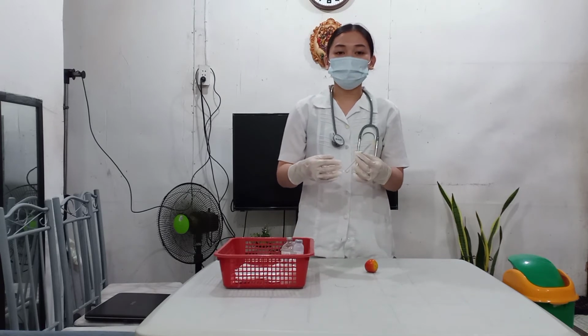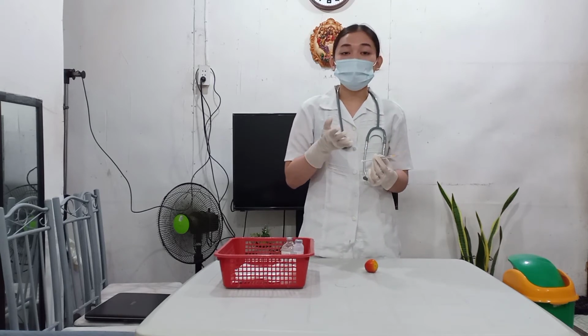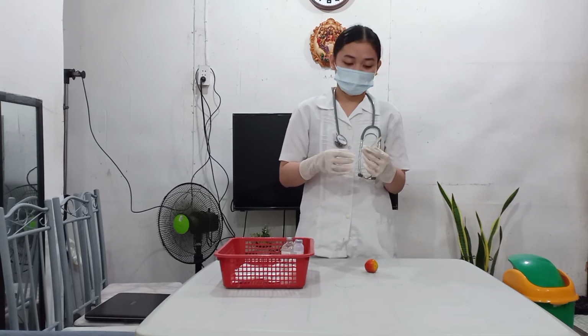So after I remove the needle cap, I will then expel any air bubbles from the syringe because this removes air from tubing that can, in larger amounts, act as an air embolus.